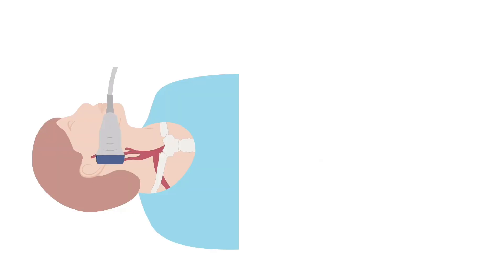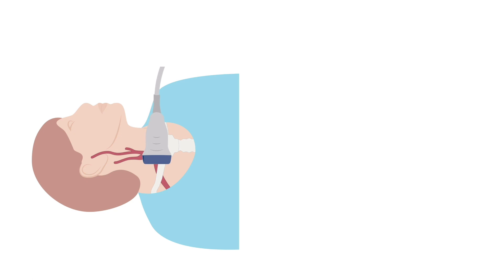Having completed the assessment of the carotid arteries, move down to the base of the neck towards the subclavian artery. Scanning the subclavian arteries can be challenging due to the close proximity to the clavicle.